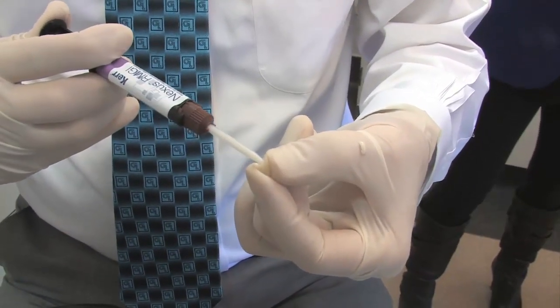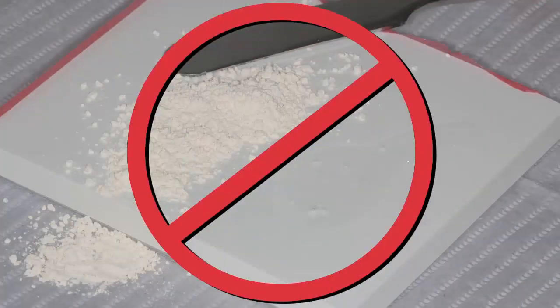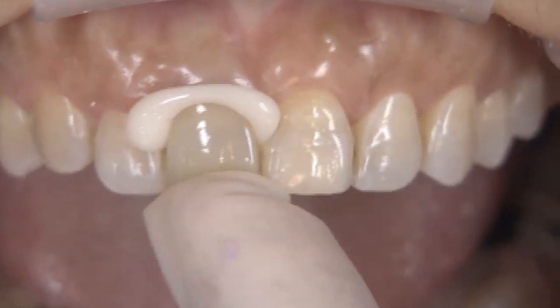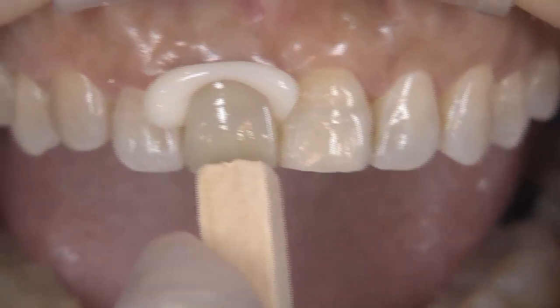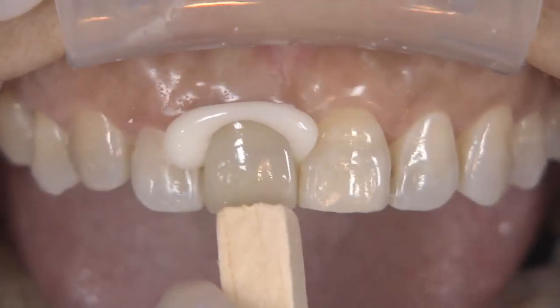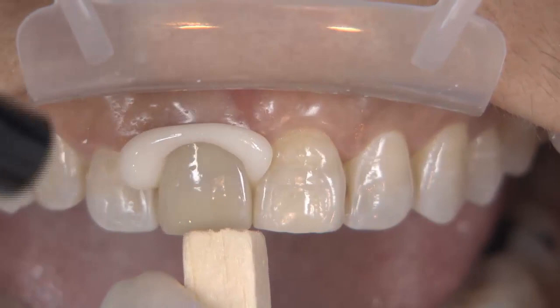I just put one little dot from the end of it on my glove, and then we're going to fill the crown. That auto-mix reminds me how nice it is not to have to mix things by hand anymore. If you're old enough like me to remember the days of Fleck's, it's certainly nice to have these auto-mix systems and not have to divide everything up into 64 piles and mix it all together. It's very convenient.